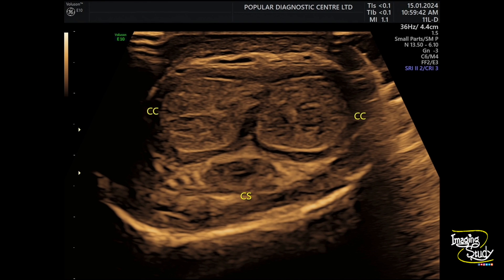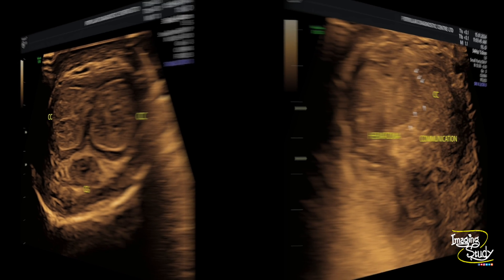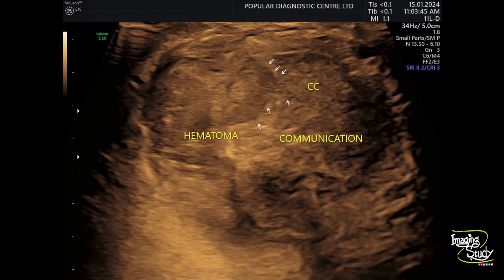Here is the normal part — you can see the corpora cavernosa on both sides and the corpora spongiosum. Now this is the hematoma. You can see the right corpora cavernosa showing the hematoma, which is communicating to the peri-albugineal region through the defect in the tunica albuginea.